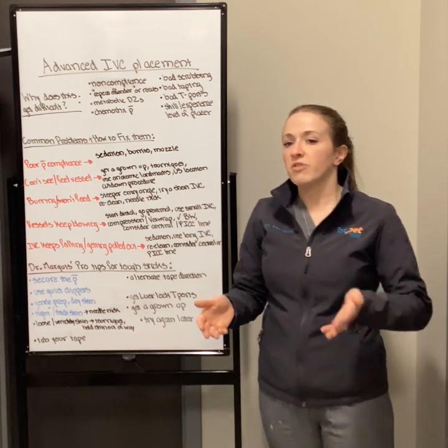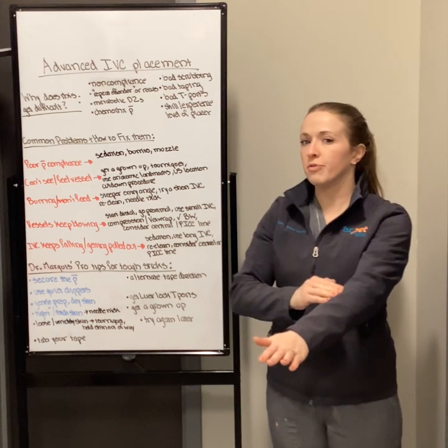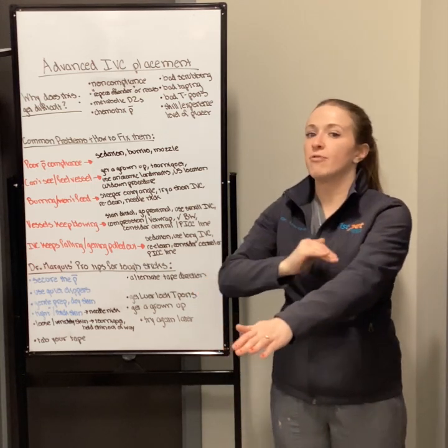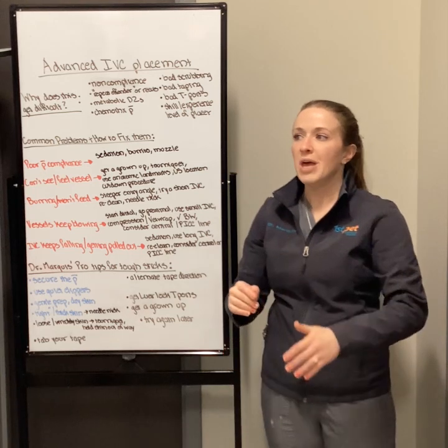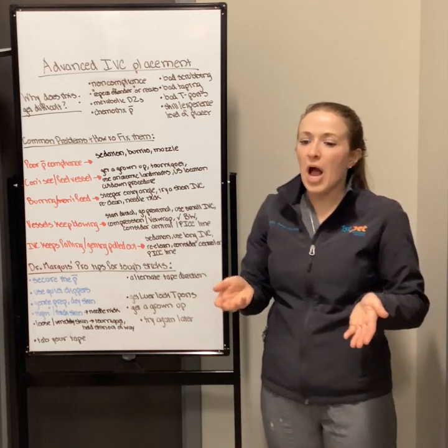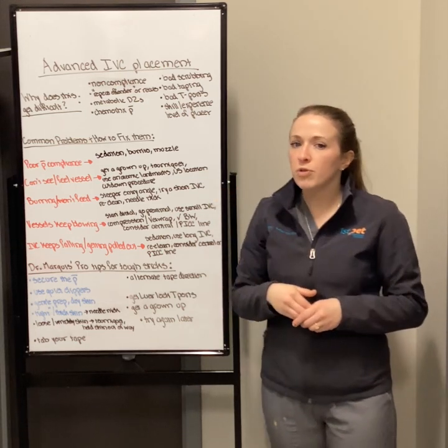So if you know that the cephalic vein is above the carpus and it lies kind of on the top part of the leg, and it usually gets pulled out when you pull the animal's skin from medial to lateral at the elbow, then I would try to feel where it is and say, I know it should be here, I'm gonna go for it. A tourniquet can be really helpful in those scenarios.